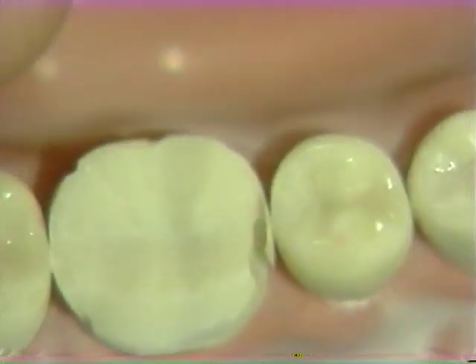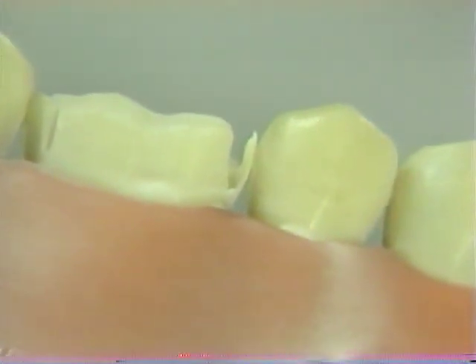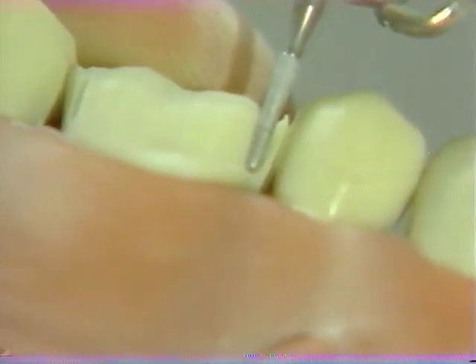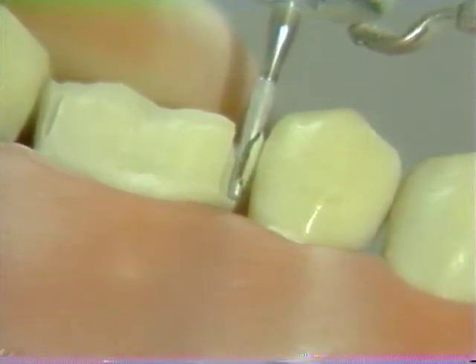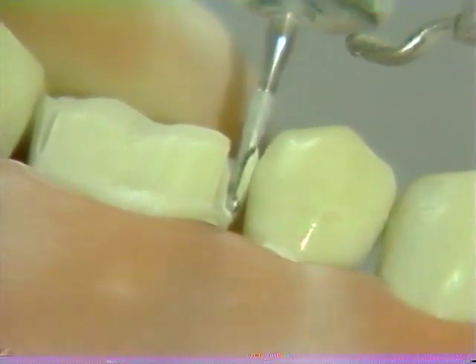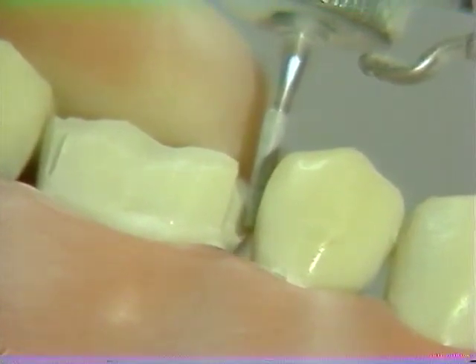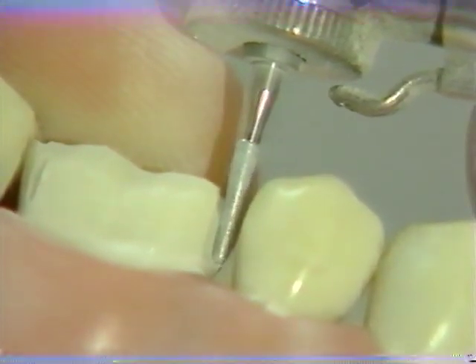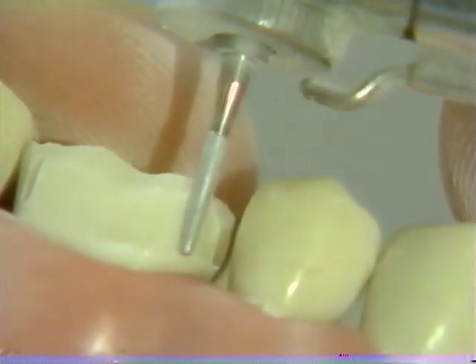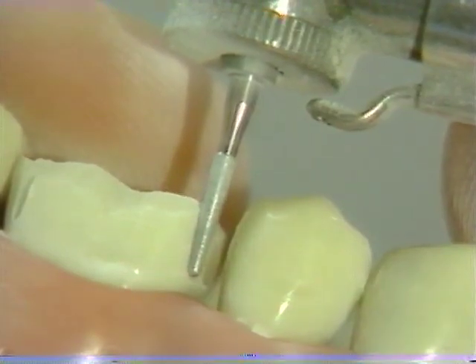From an occlusal perspective, this is the type of cut that you will have. Several passes over the proximal chamfer may be required to smooth any small bumps or irregularities that may have been created during this reduction.